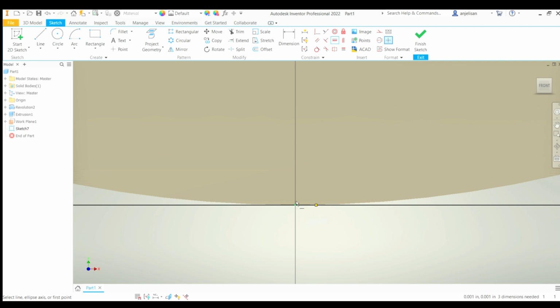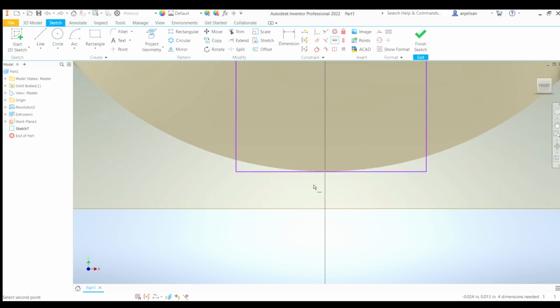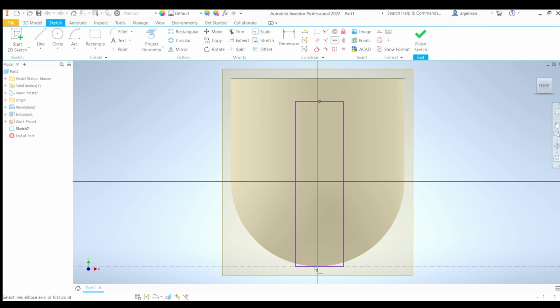Be very careful. Click on this little yellow dot, and sometimes it takes a few tries. I'll hover over this top line of the rectangle until I see the green dot, and then I'm gonna hit this yellow line. Maybe I have to zoom out. I don't think it's okay. Well, yeah, it actually is the vertical constraint. Not sure why last time I did it, it was working with the horizontal constraint. So let's finish our sketch anyway.